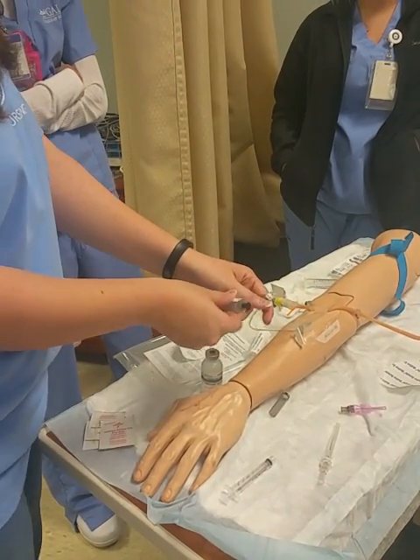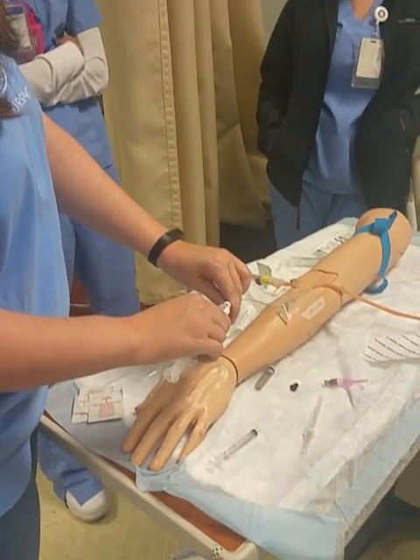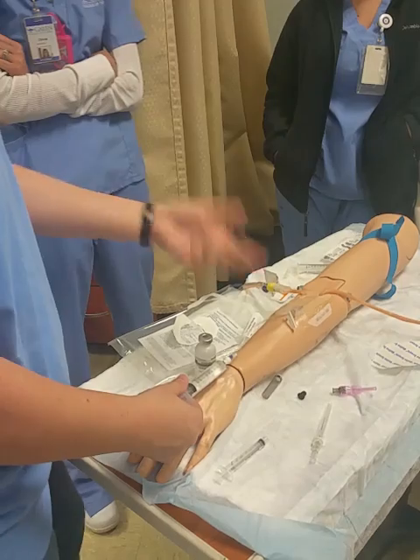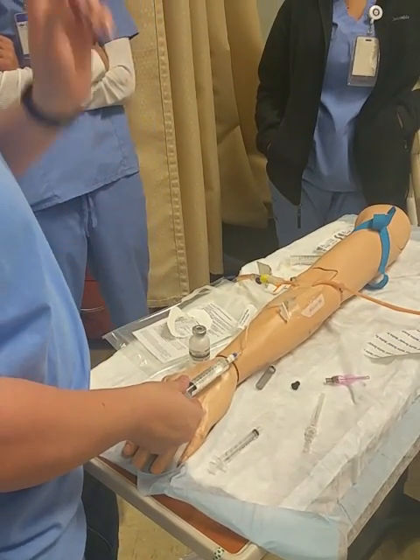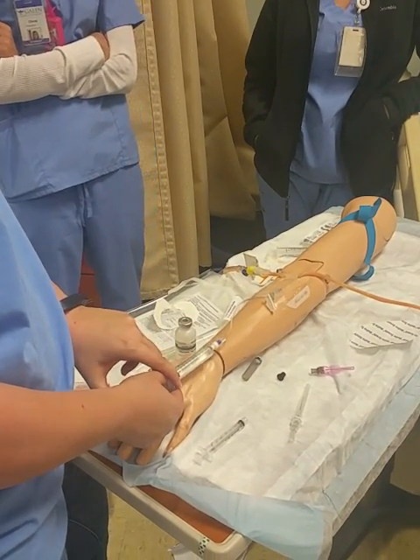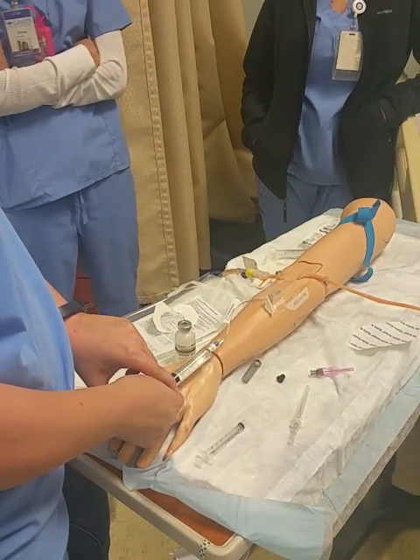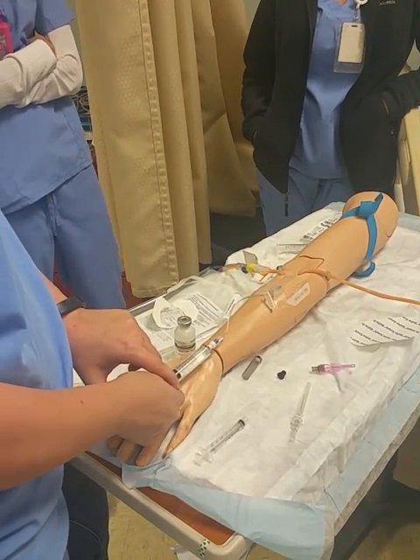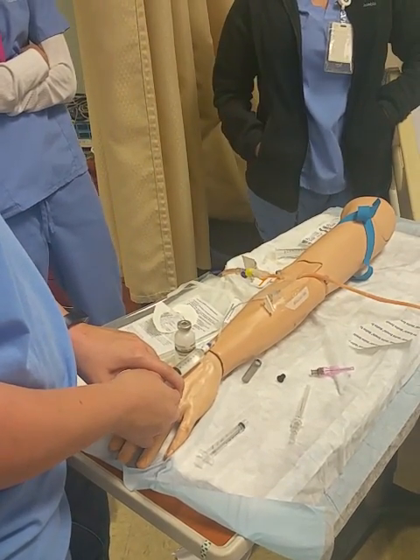Now I need my second flush. Now, here's the issue. This tubing's full of Lasix. So I need to start my flush at the same rate that I had my Lasix push going. So I'm going to push about the first 1/4 of an ml at that 15-second rate. Once I know I've cleared the Lasix from the tubing, I'm just going to go ahead and flush.